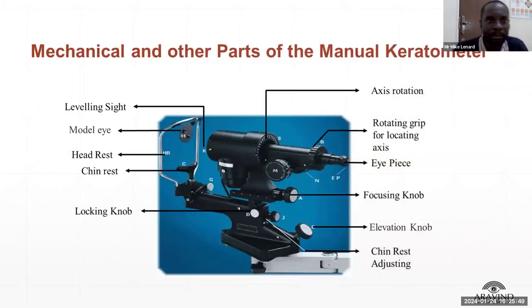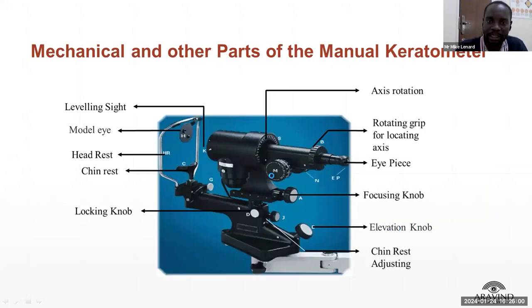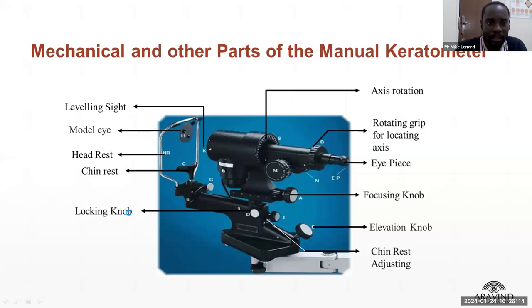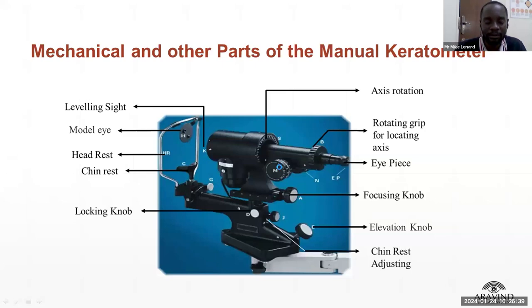For the mechanical parts of the manual keratometer: we have the elevating knob, used to lift the whole machine up or down. There is a focusing knob that moves the machine forward or backward to focus on the patient's eye. We also have a locking knob used when the machine is not in use, and rotating drums used to measure the curvature of the cornea in order to focus the mires inside.